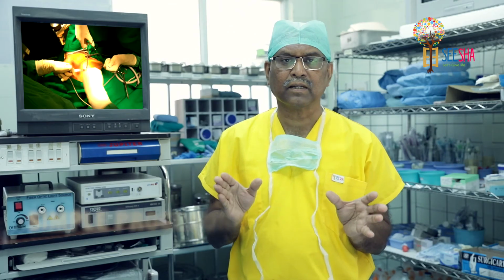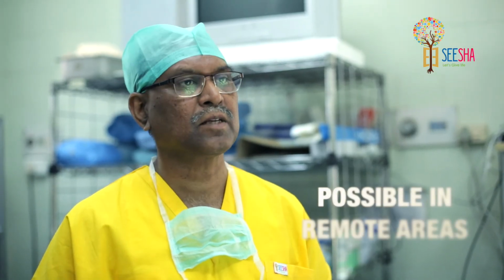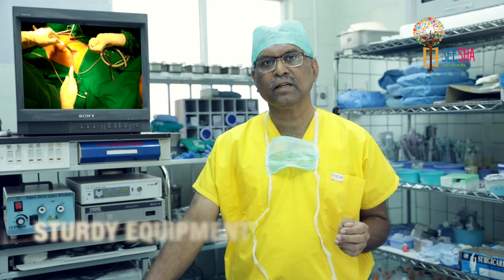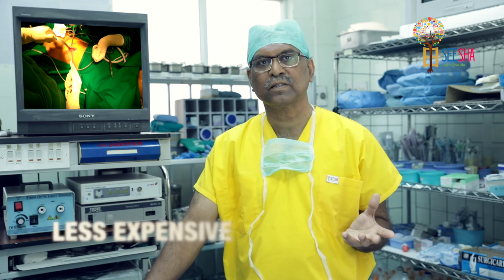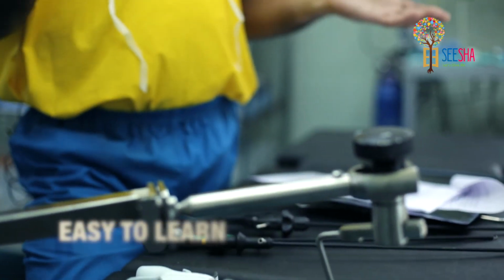In conclusion, it's a very simple procedure which anybody can do, and it's possible even in very remote areas because it's carried out under spinal anesthesia, and the sturdy equipment makes it less expensive, and the use of traditional open instruments makes it easy to learn.